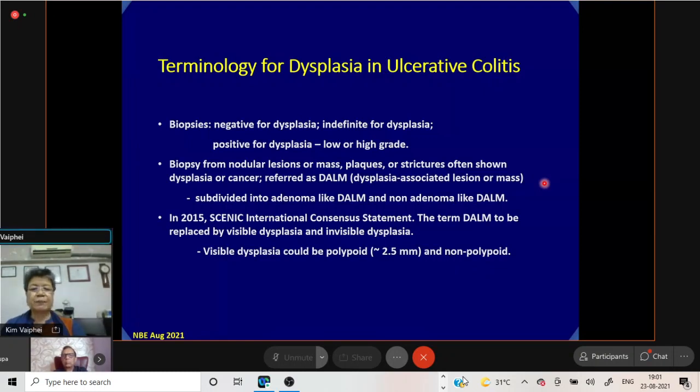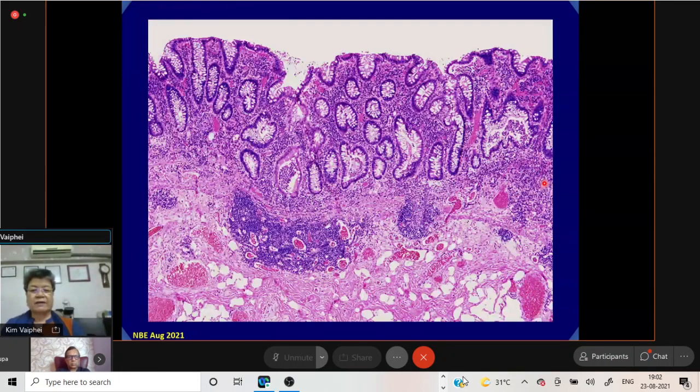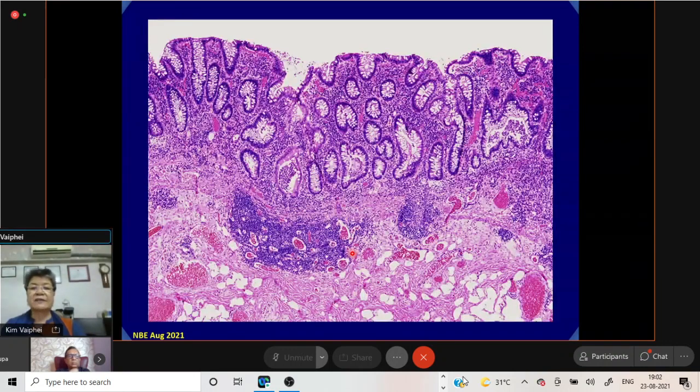So I think presence or absence of dysplasia is the important point, and any term can be used, but it should not be missed. A granuloma, which is a discrete granuloma, another discrete granuloma. Okay, so this is deep inflammation where the submucosa is involved in addition to the chronic active colitis. It could be anything. It could be ischemic also. It's not necessary that this is ulcerative colitis.